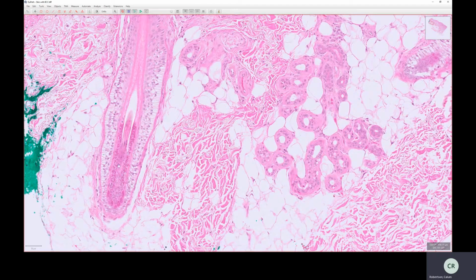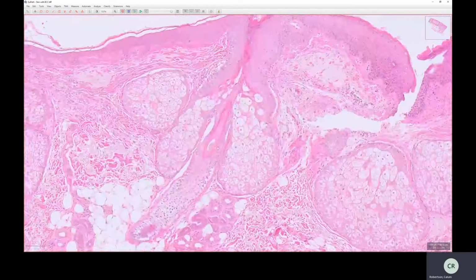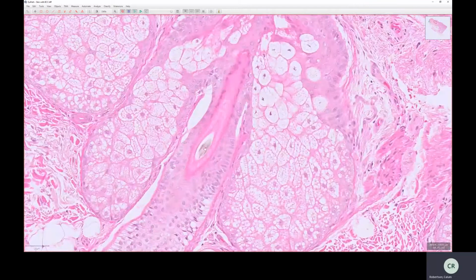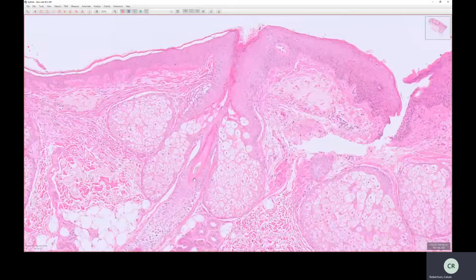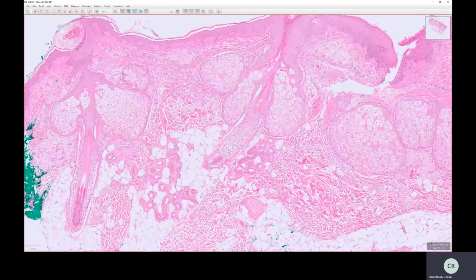And then within that, in the center, there is the hair shaft itself, which if you could see a good section, you would see it coming up. Often it's made of keratin. You can see it has this kind of brown look. It can look quite refractile. And if we had a good section, you would see that coming up here and then emerging from the surface. And that's pretty much all I have to say about the hair follicle.